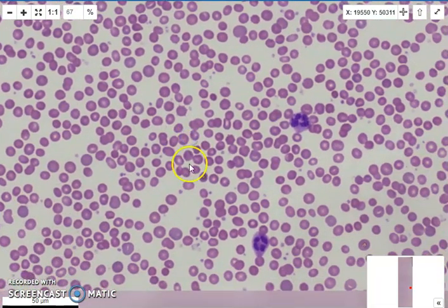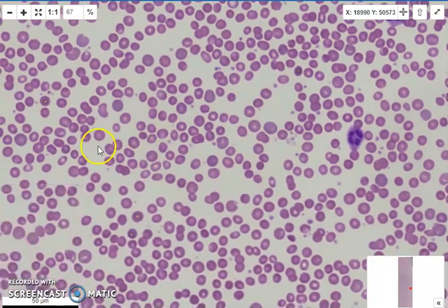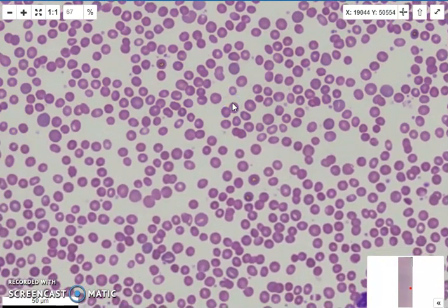And one thing that is quite common to disorders with spherocytes is a high MCHC. The reference range on this patient was 320 to 350, and we have an MCHC of 360. So often when I see that MCHC at that upper end, sort of above 355 to about 375 grams per litre, I get triggered that there may be spherocytes there, and I'll be on the lookout for spherocytes. So when I look at this blood film, the first thing that strikes me is the polychromasia.